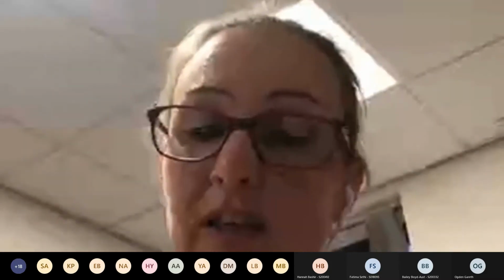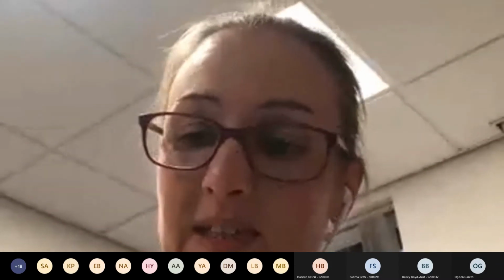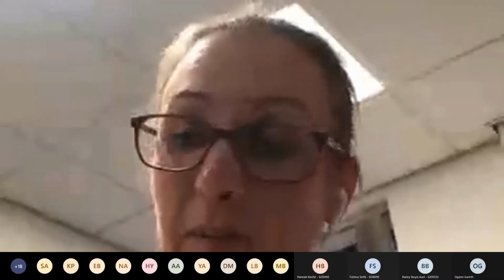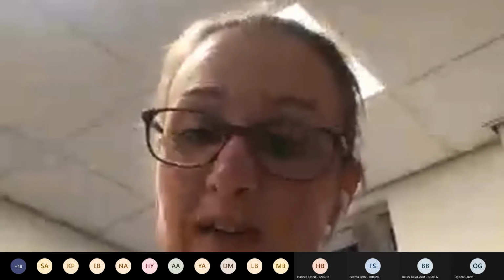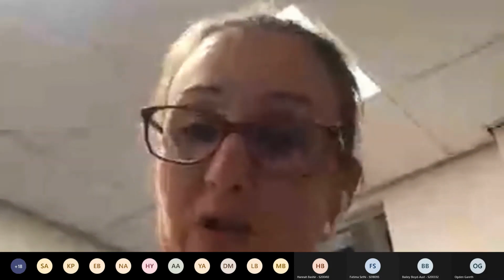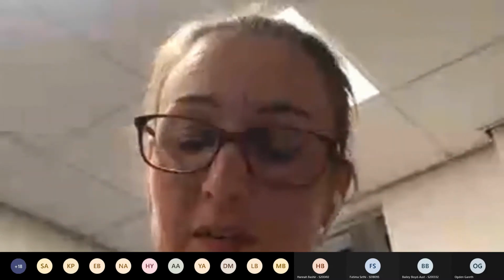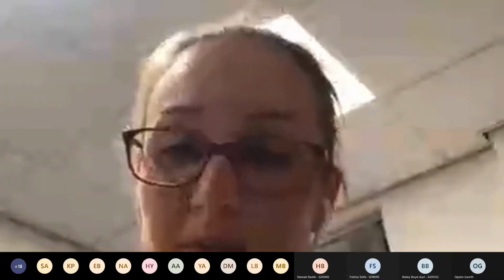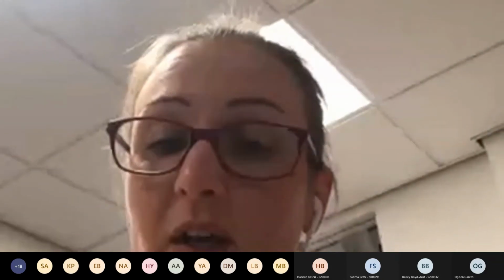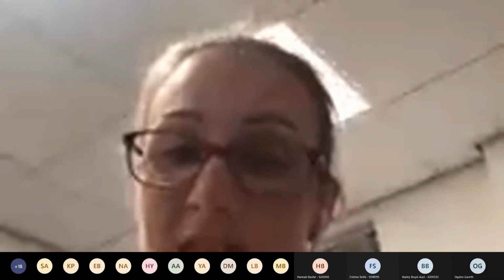So my main role over the last 6 to 9 months has been bringing these assays into the lab, testing them with samples that we know are positive because they've been identified elsewhere by known methods, running them through the analyzers and just making sure that all the results are as they say they are. A lot of manufacturers will publish claims such as how sensitive the assay is. So if you've got 100 positive samples, will it pick up all of those positive samples? That's sensitivity. We've got to prove that that analyzer matches those sensitivity claims.